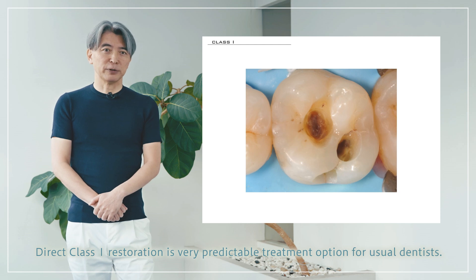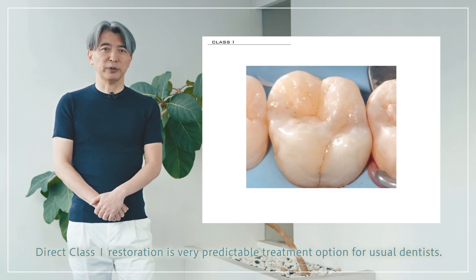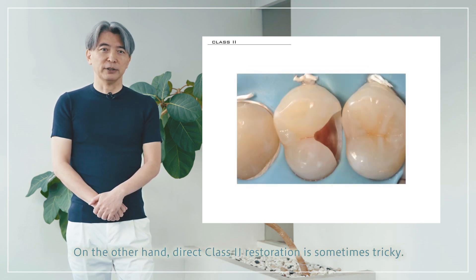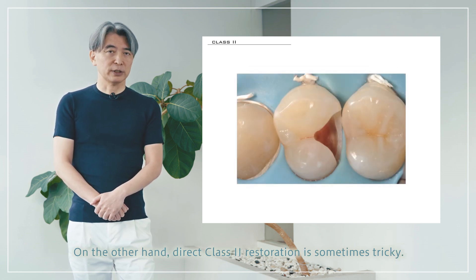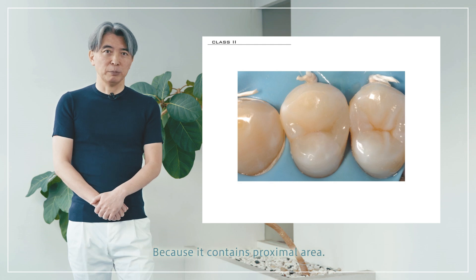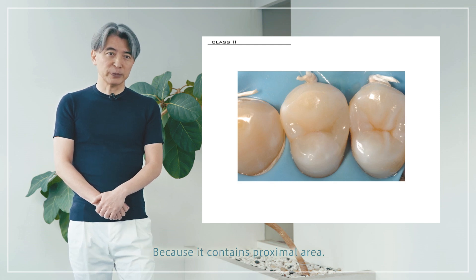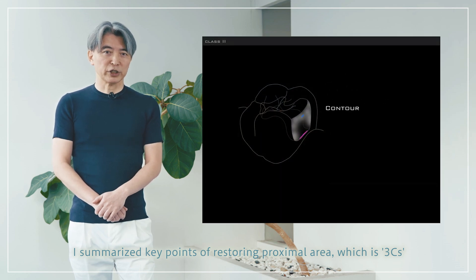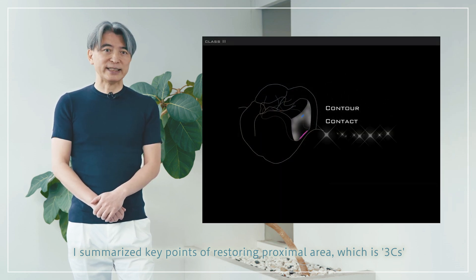Direct class 2 restoration is a very predictable treatment option for general dentists. On the other hand, direct class 2 restoration is sometimes tricky because it involves the proximal area. I summarized the key points of restoring the proximal area, which are 3 Cs.